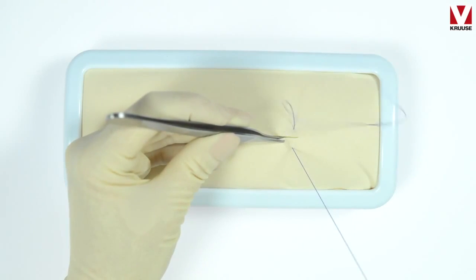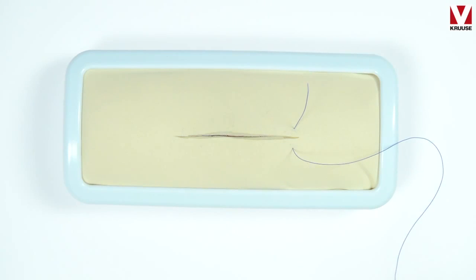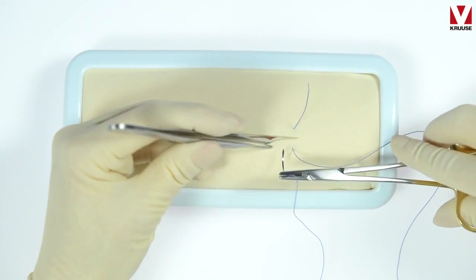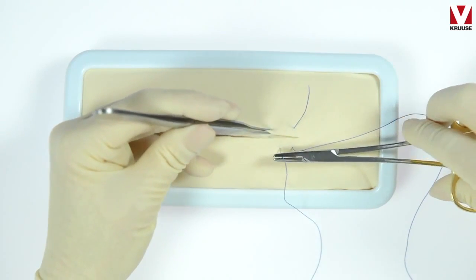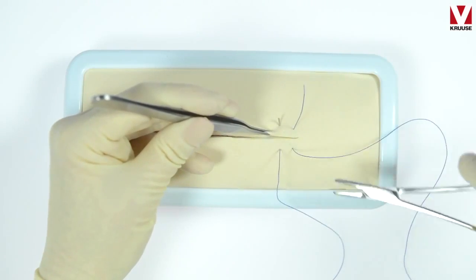If you see it from the surgeon's point of view, I start far then I go to near to myself, and then I load the whole needle holder opposite of what I usually would do in order to have the right grab on my needle.